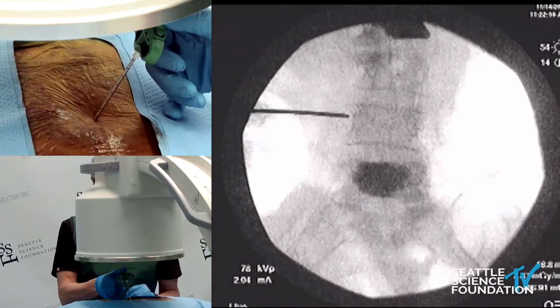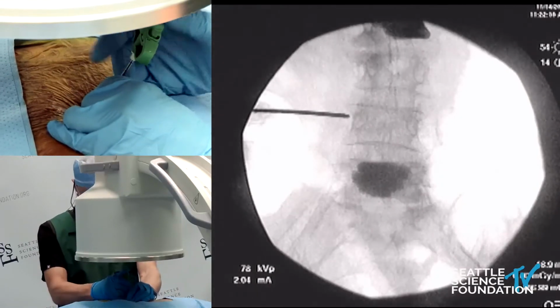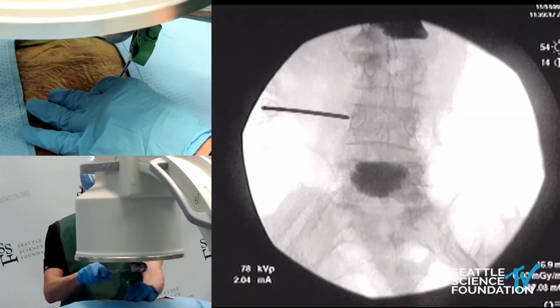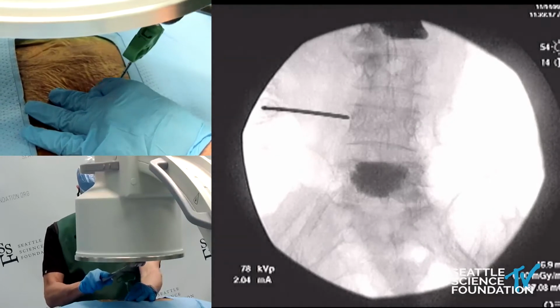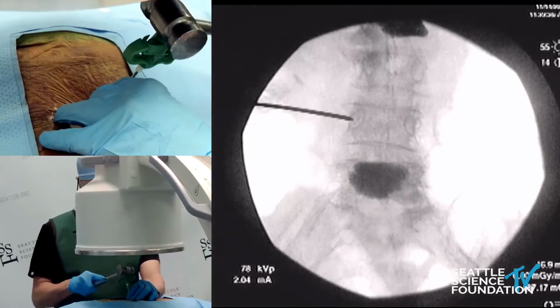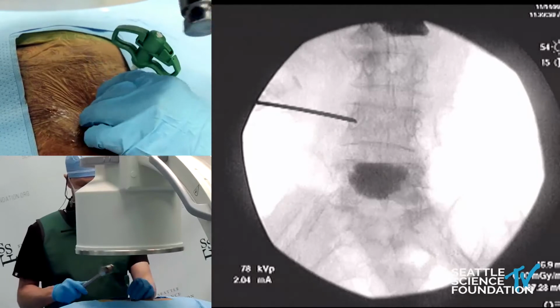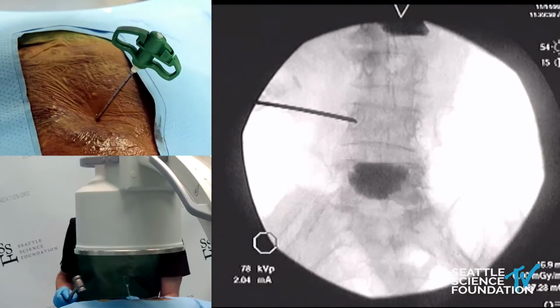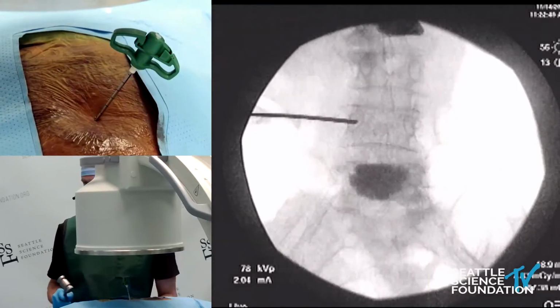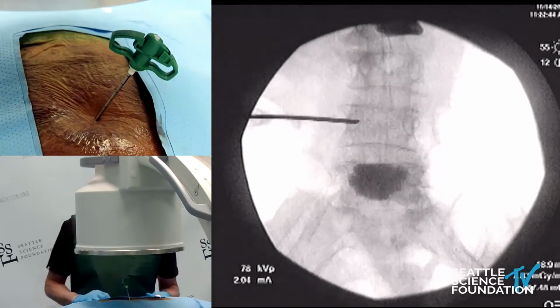And we'll target typically the 9 o'clock and 3 o'clock portions of the bone. And that's what we'll do in this case. That's fine, you're good. And what we really like to do is give this a very flat approach, meaning we want the skis of the jack to butt up against the end plate. Let's go lateral.